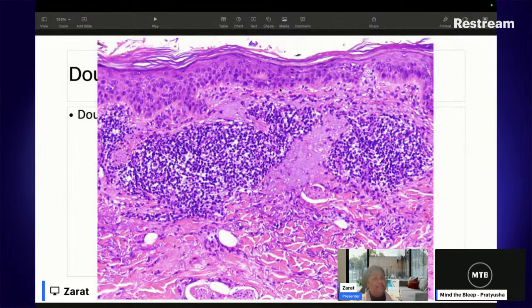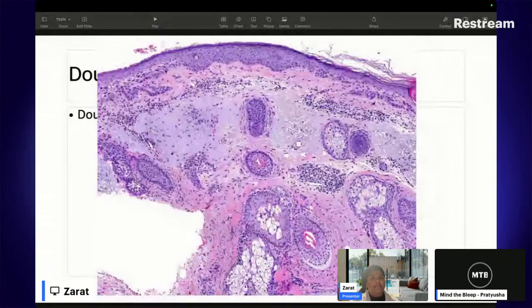And these cells might not look like the ugliest cells ever, but they don't look nice and normal. So again, if we go back, these are the cells here, nice and normal. But if you look at the cells here, they don't look as nice as that. And again, you need a bit of training of your eye and you need a bit of imagination. Actually, you need a lot of imagination to do histopathology. But they don't look as nice. So I am worried about it.